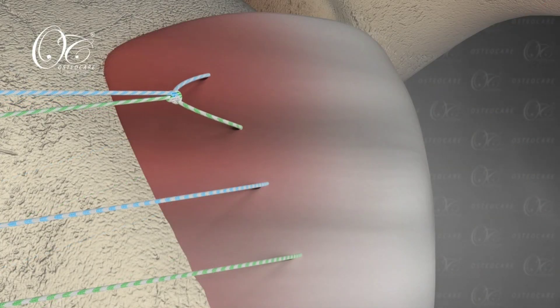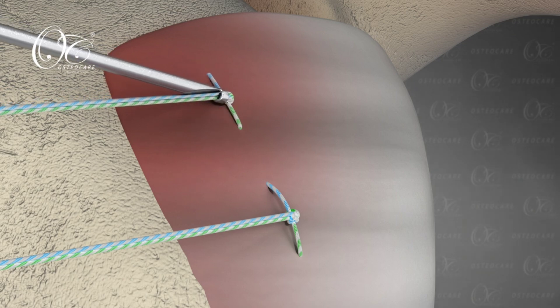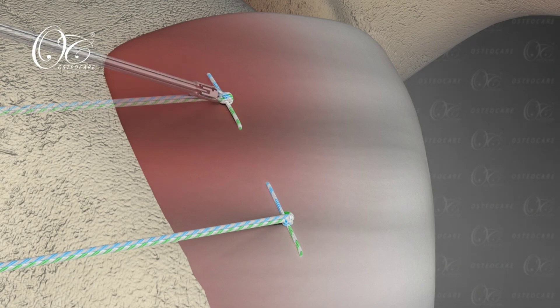This is a safe technique and protects against any inadvertent eye and face injuries of the patient while putting the anchor through the anterior superior portal.